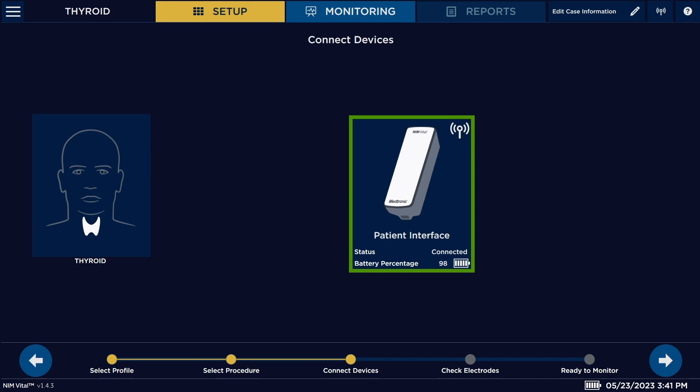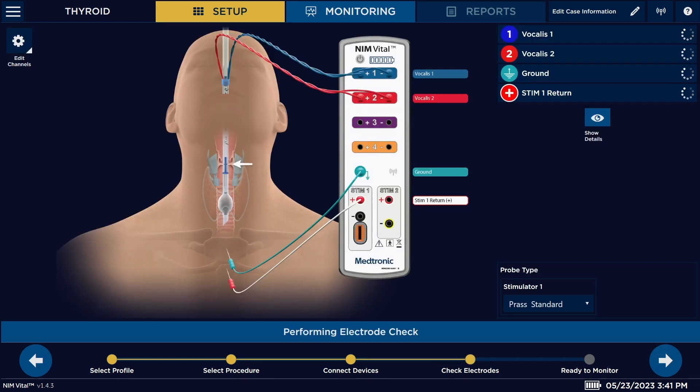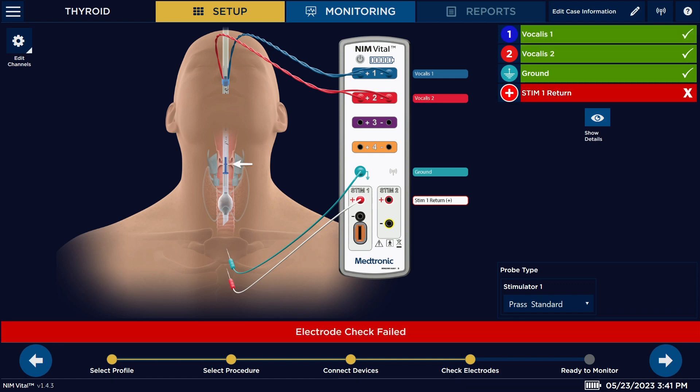Hit the arrow and now it's going to go to connecting our electrodes. For a thyroid, we're using an endotracheal tube, so the electrodes from the endotracheal tube are going to have to be connected to the interface. Blue on the blue channel, red on the red channel. Your green ground and your return electrode get connected. They will flash if there's nothing connected and the system is asking for that connection. Once you have everything connected, they'll go solid.